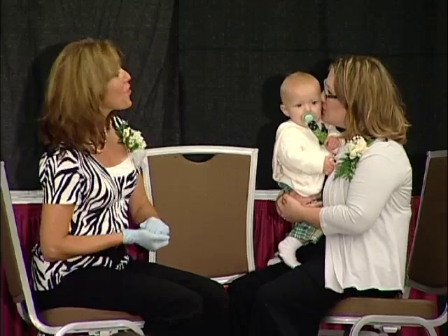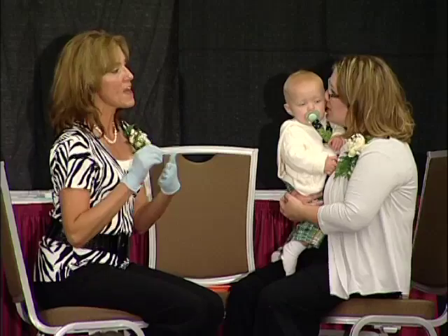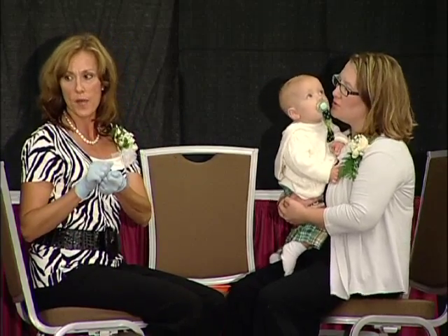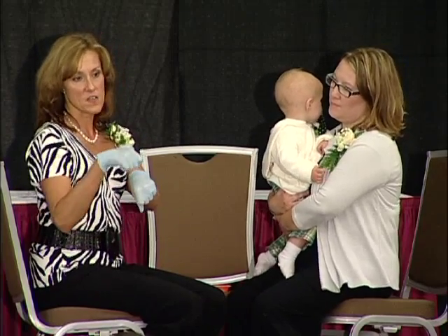Let's see. Fluoride applications. I did not bring the fluoride with us today. We buy the fluoride varnish in the clinic pack. So it's just a little tear open. We actually squirt it on the backs of our gloves. We kind of mix it around.